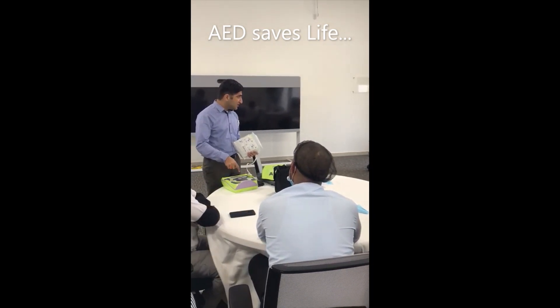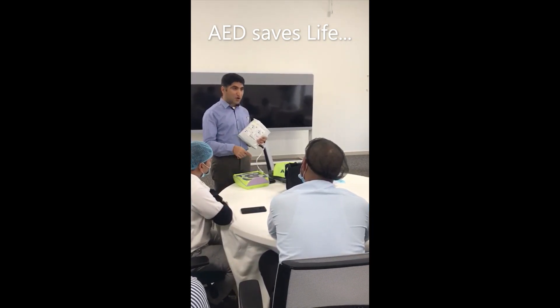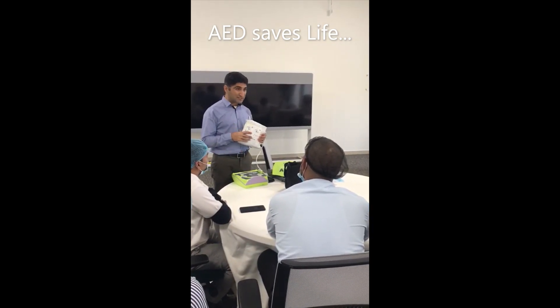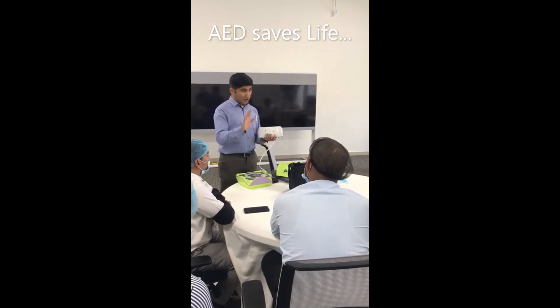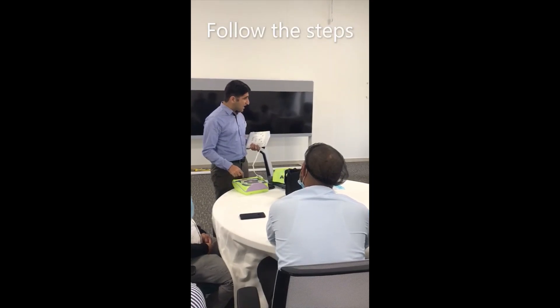There is one cycle procedure. It will speak by itself — it is an automated defibrillator. Already it is saying stay calm. No need to be very much stressed. So what you will do is follow these steps.